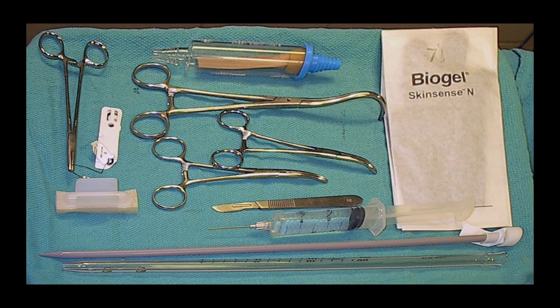Equipment: local anesthetic with either 1 or 2% lidocaine, with or without epinephrine, should be administered to the patient, provided that time allows. To this end, a syringe with a 22 gauge needle is required. A number 10 or 15 blade, a basic procedure tray, a chest tube varying between 28 to 40 French, as well as an O-silk suture to secure the chest tube to the patient, and a drainage collection system. These may include an Atrium, a Pleur-evac, or Sahara.